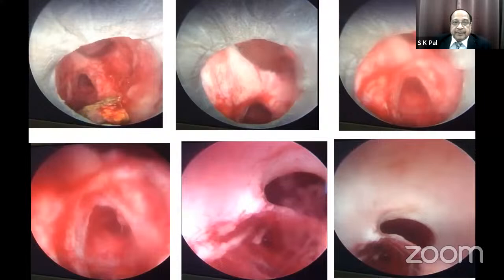And this is what happened by mistake. There was an injury just below the infundibulum. The stone was lying here, and this was the injury. This was the infundibulum leading towards the pelvis. This was the injury. You go closer to the injury. When you see the injury during dilatation of the tract, when you go inside, this is what was seen.